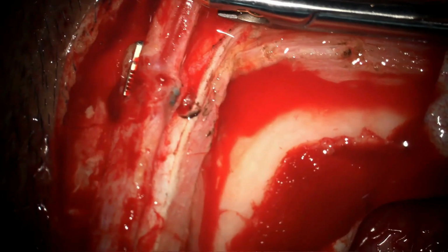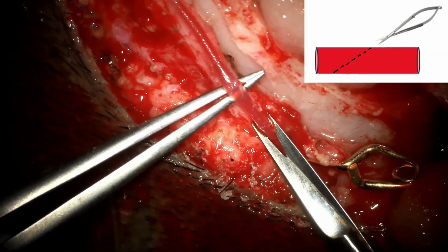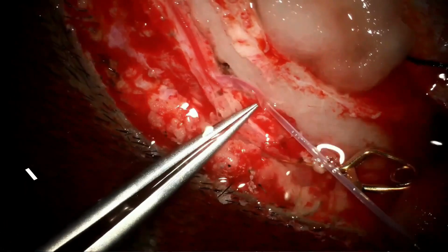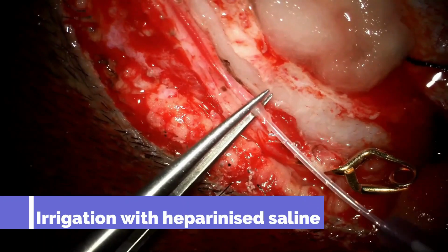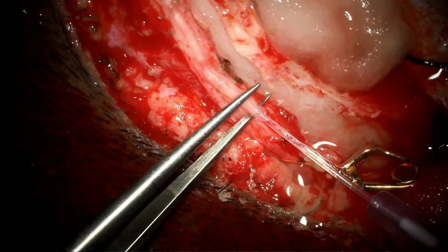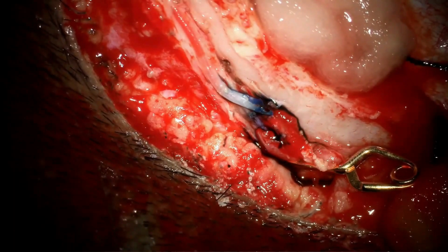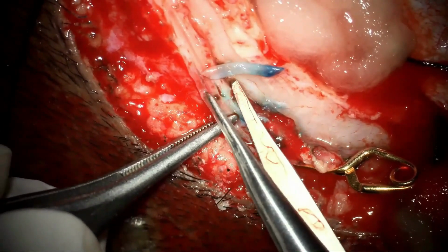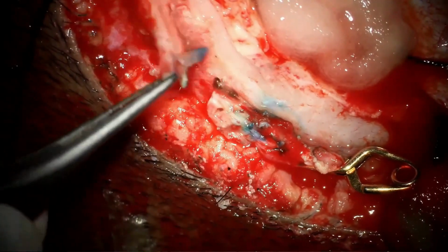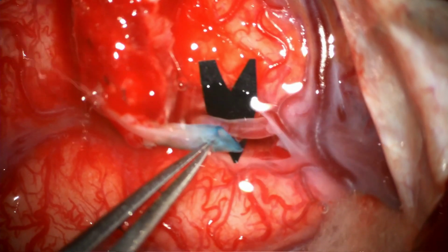The STA is clamped proximally using a temporary clip and then sharply cut in oblique fashion after clamping it distally too. After that, the STA lumen was irrigated using heparinized saline. Staining is done using methylene blue dye at this oblique transection, and then the perivascular tissue is completely disconnected to mobilize the STA towards the recipient M4 MCA. The size of the oblique opening of the donor STA is judged for the arteriotomy of the M4 MCA.